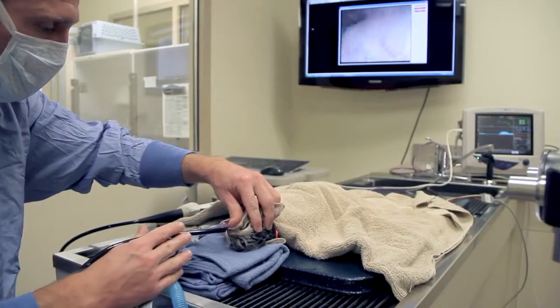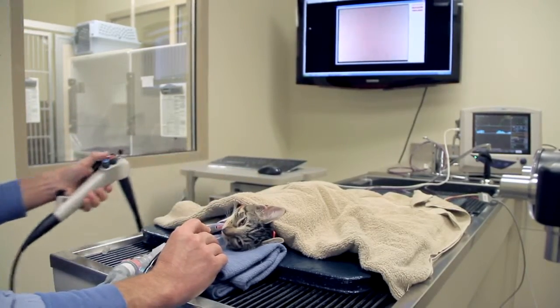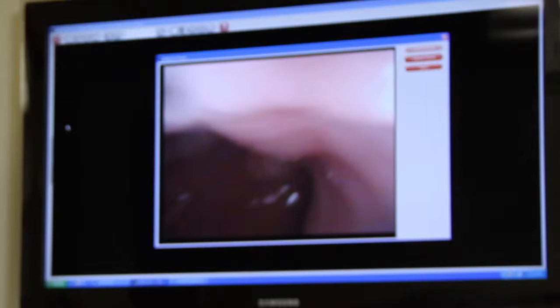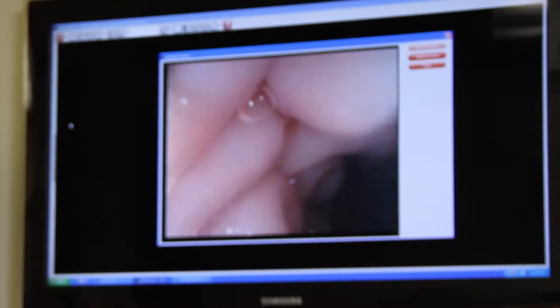Endoscopy is a technique that we use to look inside any orifice of the body. So we use endoscopy to go into the mouth, to look down into the stomach and into the small intestine. Colonoscopy is where you come up the back end. Rhinoscopy is where you can look up in the nose. Otoscopy is where we look in the ears. So any orifice would be considered endoscopy.